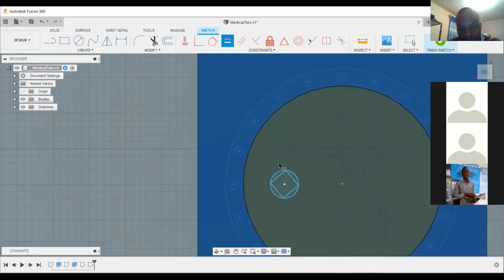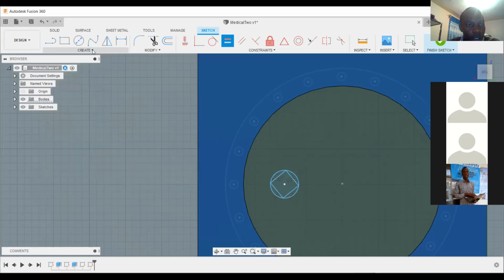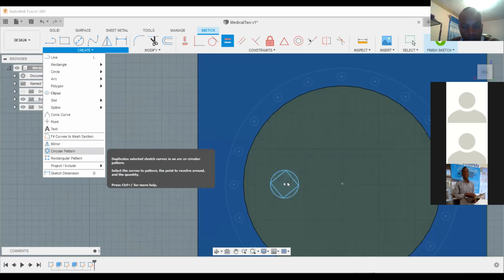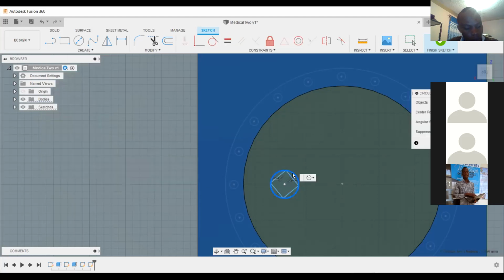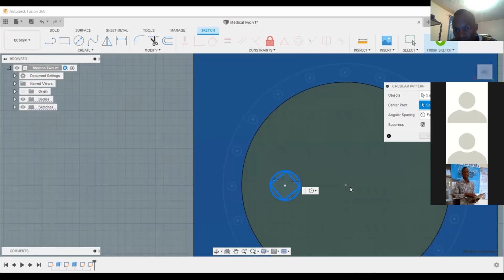So the guy who was asking about this, how to create a pattern of this. So you come to create, then circular pattern, create circular pattern. Then you click on the circle plus the lines. So you click on everything so that everything is blue. Then there is this floating part which is telling you circular pattern. So you select center point, you select the center of the circle.